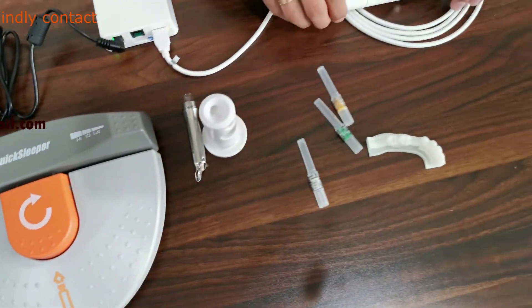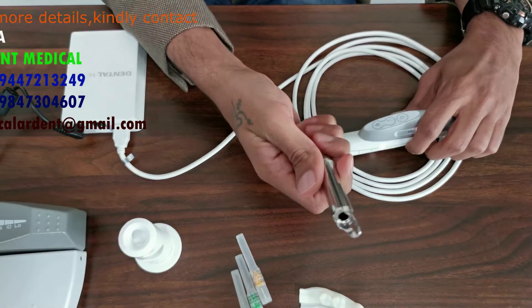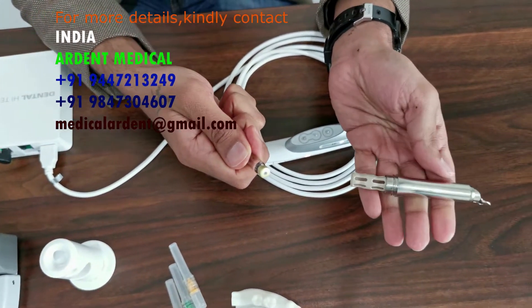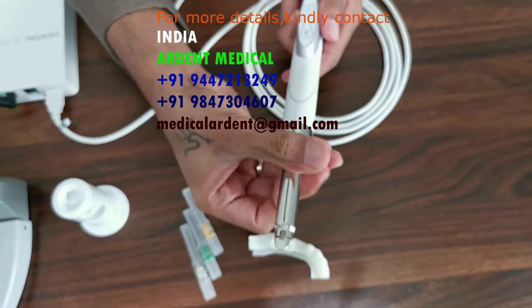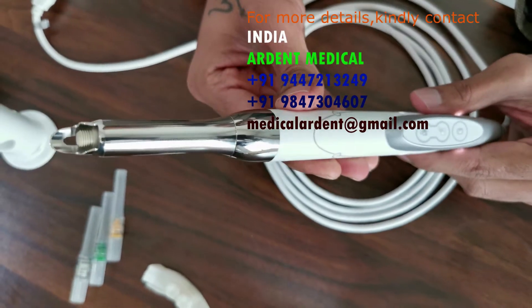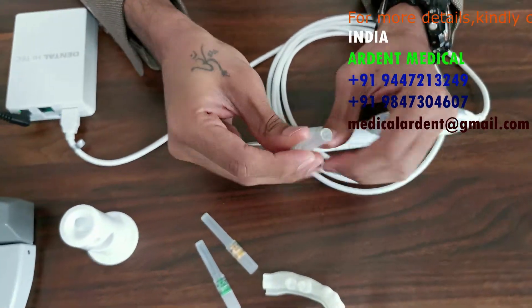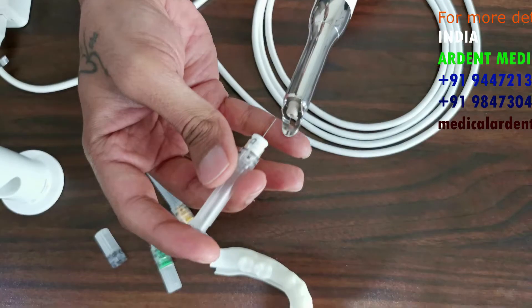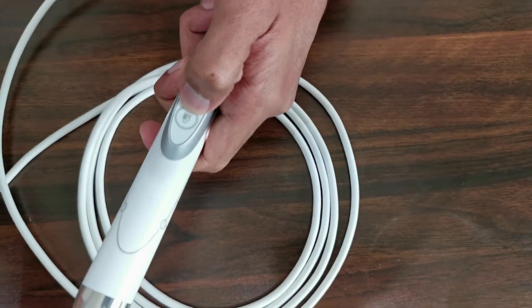Now let's move on to how we can attach the patented DHT needles onto the device. You have the steel rotary container with a compartment to which we attach the carpule. Hold the handpiece, hold it in proximity and just rotate it. Now the device is attached alongside the carpule and the container. To it we add or attach our DHT needle. These are patented needles. Hold it like this and press the screw button continuously.